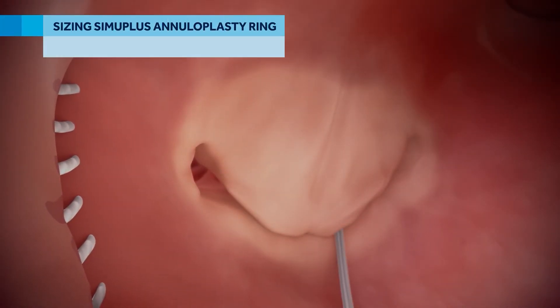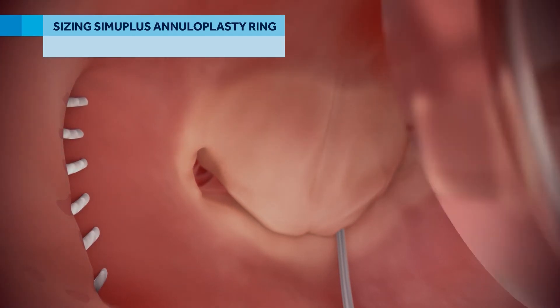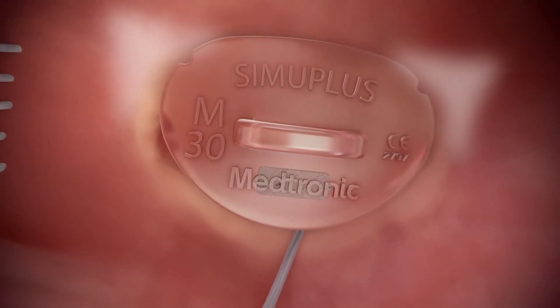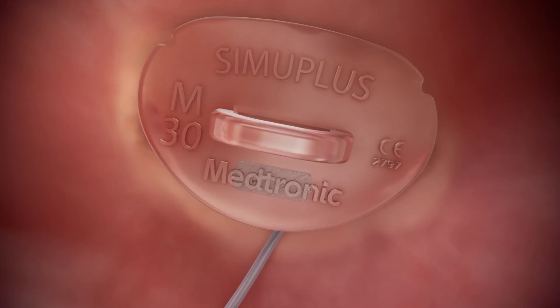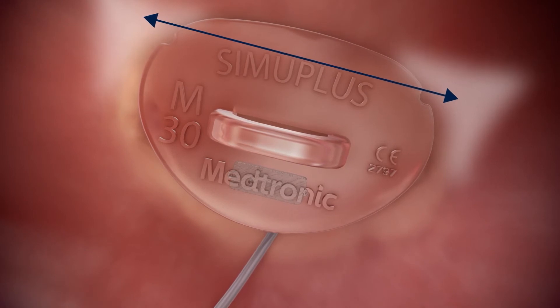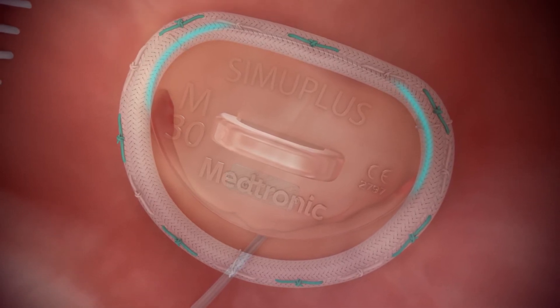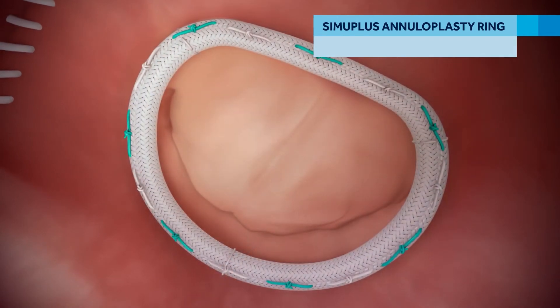To determine the proper SimuPlus flexible annuloplasty ring size to implant, lower the sizer onto the valve annulus and align the trigone markers on the sizer with the trigones. Determine the appropriate mitral ring size by locating the sizer with a trigone marker spacing that best corresponds to the intertrigonal distance. The outer edge of the sizer shows where the implanted ring will sit on the valve annulus. SimuPlus rings are length and size to the trigones.